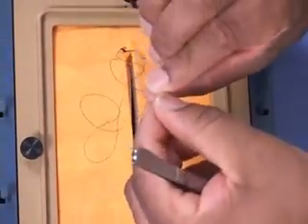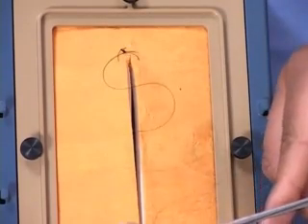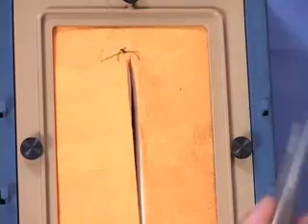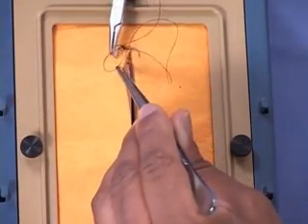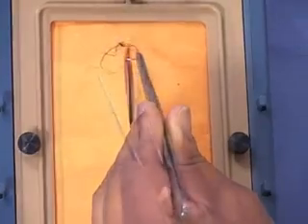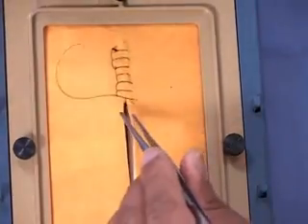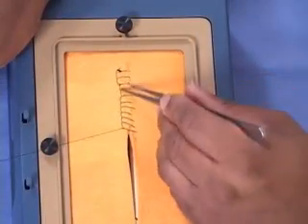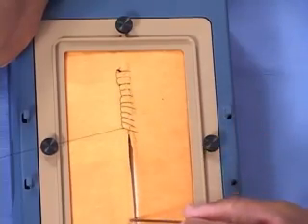Now, when you pull up, you will see the pattern that is created. Our goal now is to duplicate that pattern all the way down the wound. Notice the pattern that is created. We would continue this stitching pattern over the whole course of the incision.